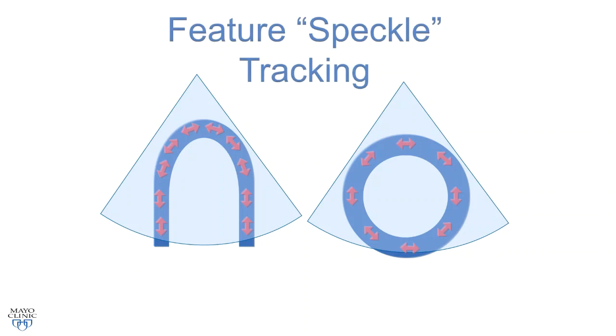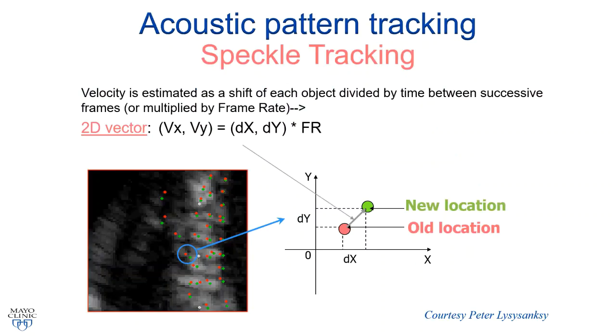So to overcome this, we can look at things such as speckle tracking, which allows us to look at both longitudinal, circumferential, and even radial parameters of motion. So speckle tracking uses a completely different approach than Doppler tissue imaging. This is an image analysis method whereby we identify a unique acoustic fingerprint, a pattern of individual speckle elements of the myocardium, and we track this pattern frame by frame. This allows us then to define the parameter of deformation truly in the axis of motion as opposed to the axis of the ultrasound beam. So speckle tracking, by principle and definition, would be angle independent.